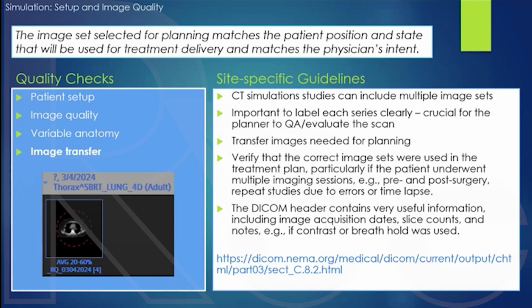Then it's important to verify that the correct image sets were used in the treatment plan. And in particular, this is important if the patient has undergone multiple imaging sessions. So for example, pre and post-surgery with repeat studies that could be due to errors or time lapse.